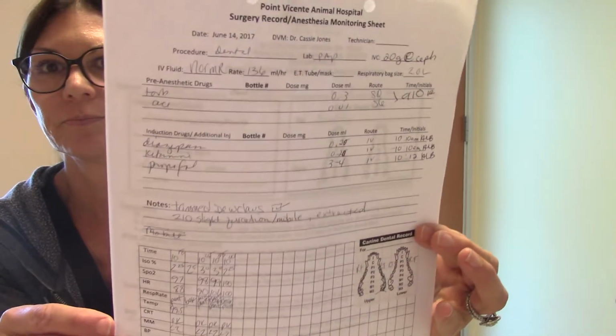Okay, this is Task 6, I'm going to monitor using an anesthetic chart. We actually have a patient that just had a dental, and I've got the surgery records right here from the dental. So I'll go over how the physiologic status and the reflexes affect how we monitor.